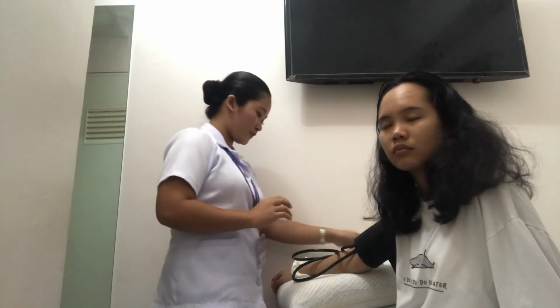This is to avoid missing the auscultatory gap, which is the temporary disappearance of the Korotkoff sounds while deflating the cuff. For the actual procedure, I'm going to use my stethoscope, but first I'm going to disinfect the earpieces, diaphragm and bell of my stethoscope.